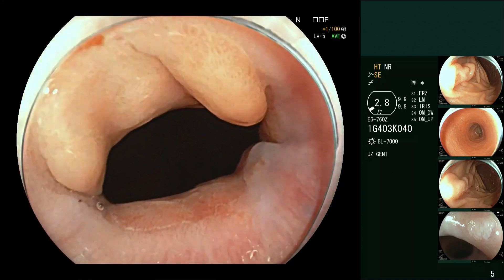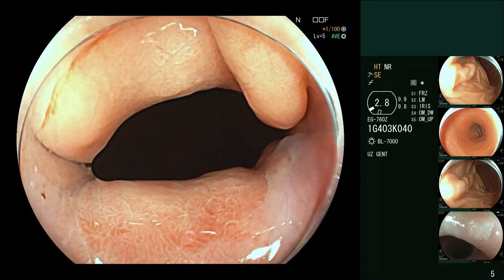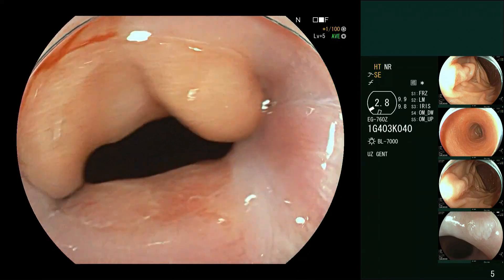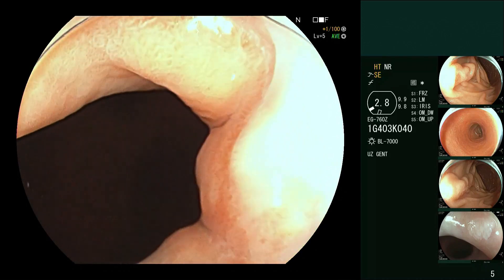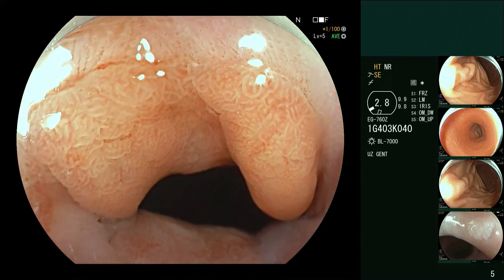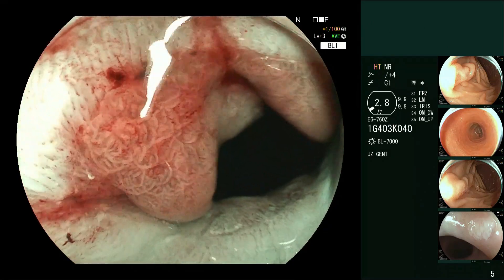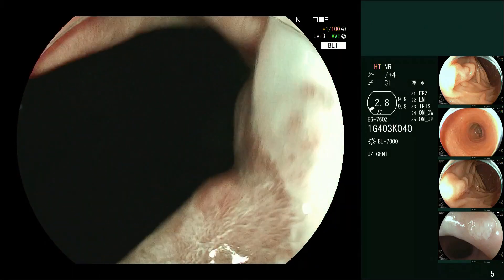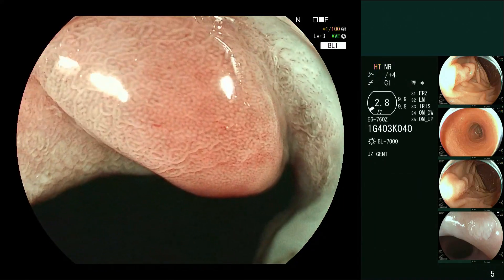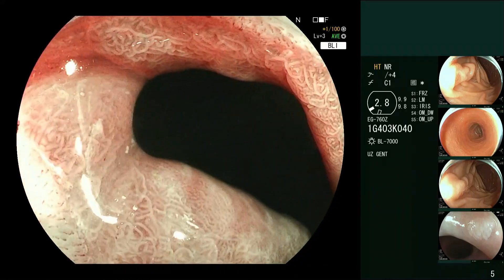We'll now look at the esophagus. If you are using a cap, it can be very useful for examining the gastroesophageal junction. We put on a bit of magnification to see the whole thing, coming back and looking all the way around. We look at it in white light, looking for erosions and evidence of reflux — I don't see much here. Then we put it to virtual chromoendoscopy and look for an abnormal pattern. The cap is really super helpful for this; without a cap, I think you would struggle to do this.